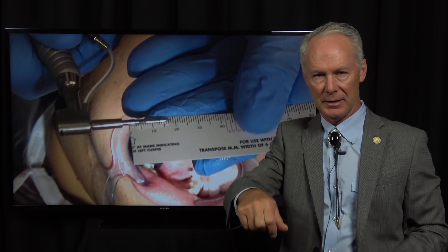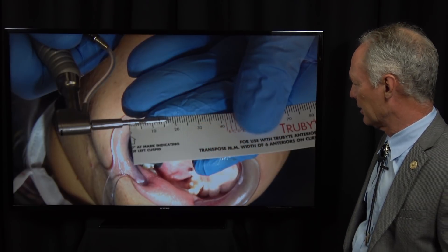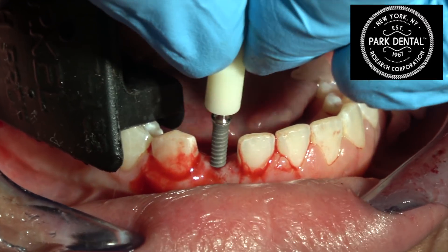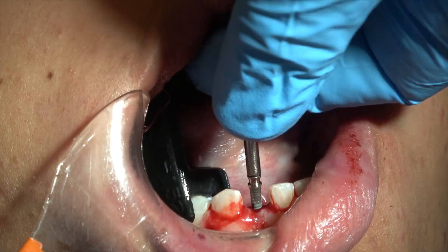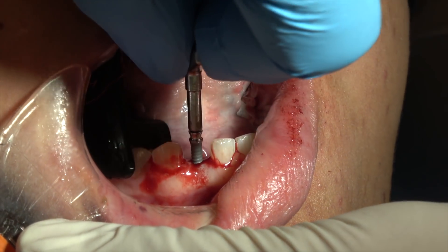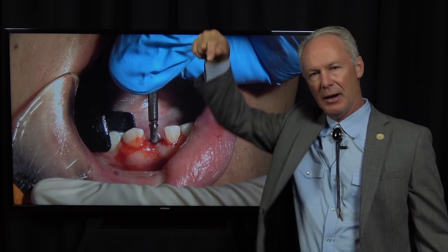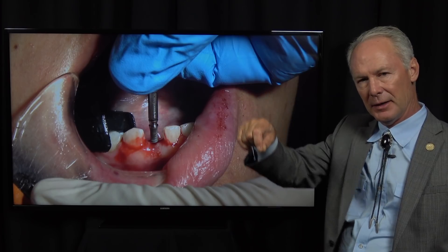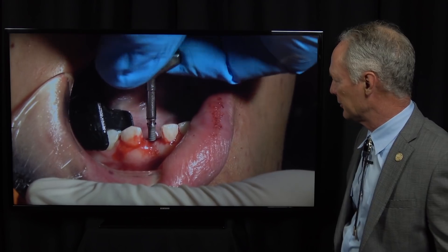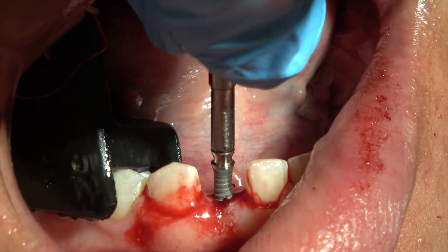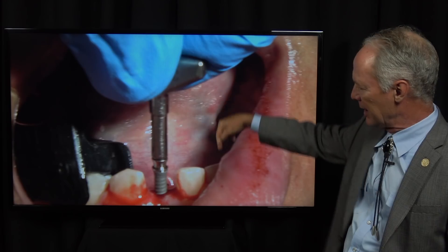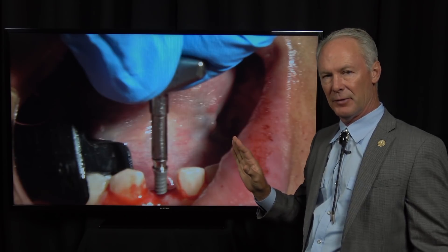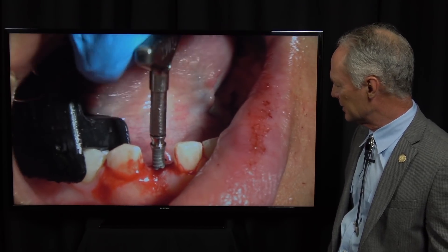The 2.0 will self-advance if you don't drill to depth, but I want a larger implant since I'm using it to support a crown. We're using a 2.5 millimeter small diameter implant, 17 millimeters long and 2.5 millimeters wide. I'm screwing it to place. I drilled to depth because it's a wider 2.5 millimeter implant and I wanted to determine the channel precisely since it's in close approximation to the adjacent teeth — I didn't want that implant winding off course as I advanced it. So I go just a little bit, screw it in just a little bit, then check alignment to be sure it's perfectly aligned. In the first 25 to 30 percent of advancement you can put pressure on the implant and influence the channel it's advancing into.